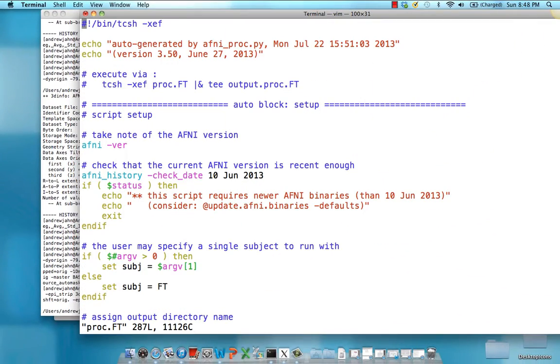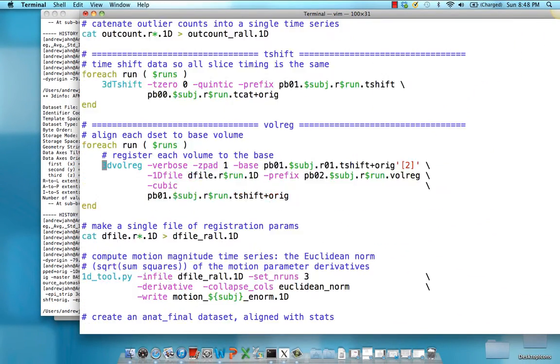Another thing to look at after this VOLREG step is the 1D tool. Instead of having six separate motion parameters, it essentially collapses all of them into one file, and anything above a certain threshold can then be censored when we feed it into 3D Deconvolve. That's saved in the motion_subject_enorm file.